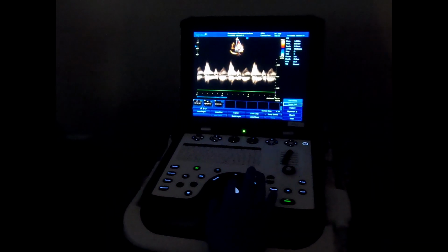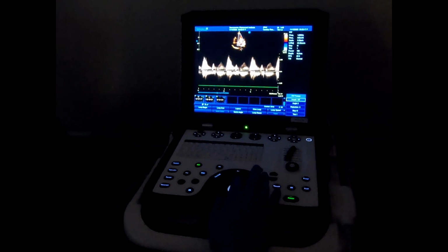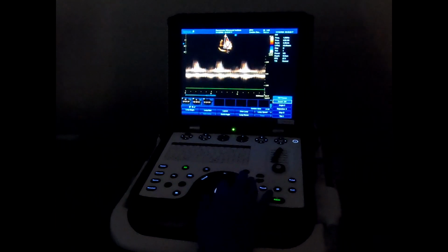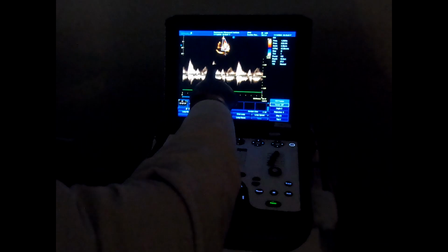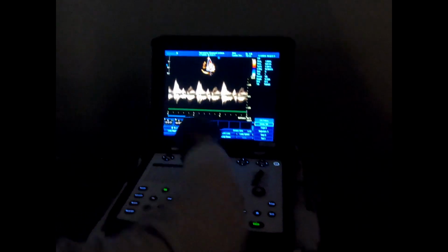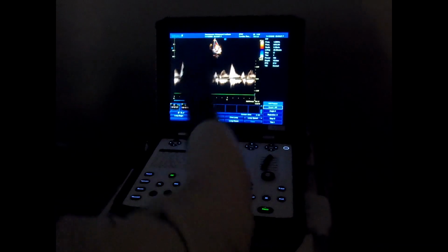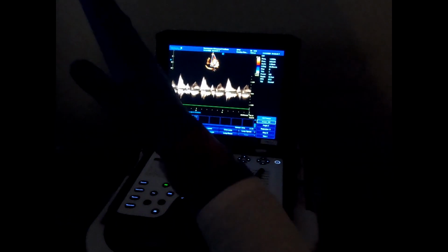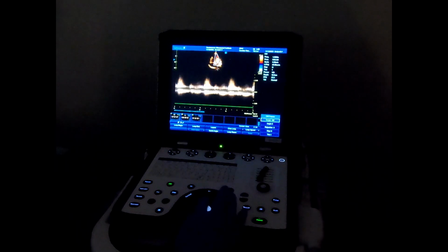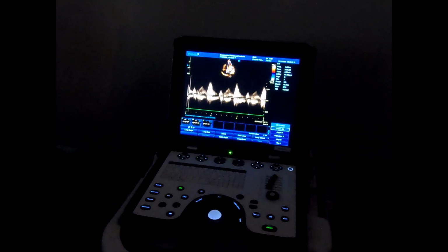So we got too many cycles. Which one can you go with? The one which has a sharper edge, you go with. This one is a cleaner one. As long as you're able to exclude that little bump there, this is also good. Either one. How come the one on the left isn't good? This one has a little concave shape. The best one is to get the sharp edge. They all have that shape though. Yeah, you need to live with that.